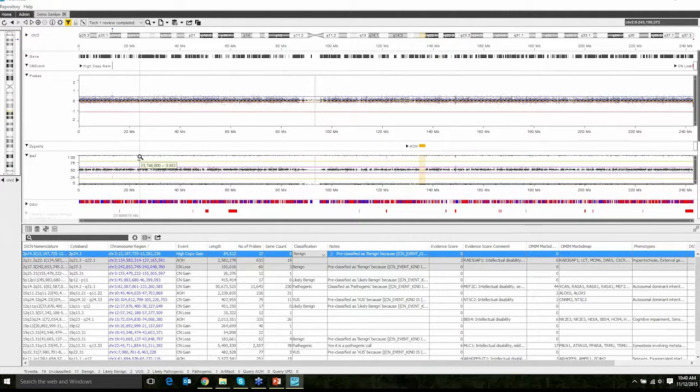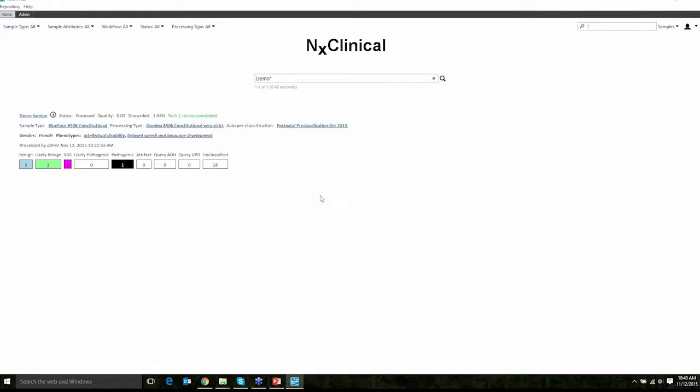So this was the part that I want to cover as far as a quick end-to-end. The software also allows you to visualize trio samples, so you can look at the trios, the father, mother, and the affected child, or if it's cancer, you can have cancer normal or metastasized, and at diagnosis, you could do that. And I'm going to stop this. I do want to allow more time for Q&A.